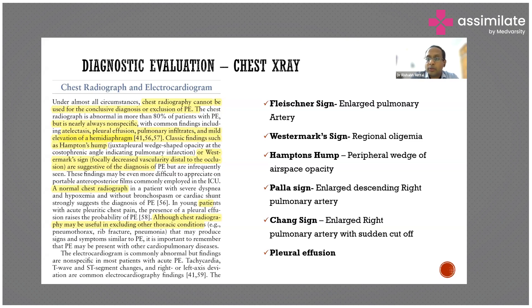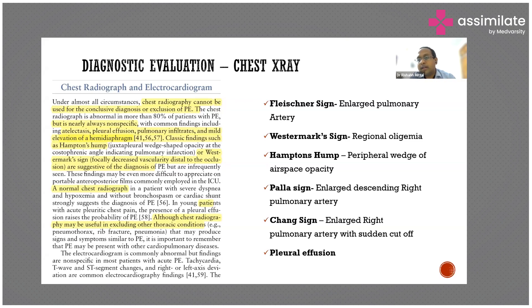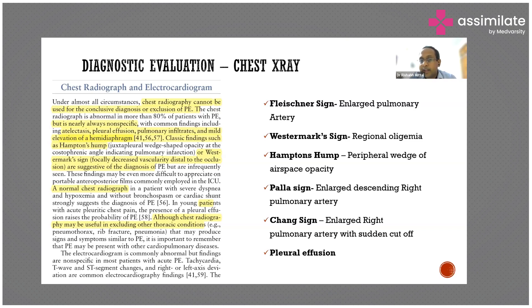Hampton's Hump is another frequently asked question. It represents a pulmonary infarct — the embolus goes to a distal pulmonary artery, blocks the blood supply to that part of the lung, and that part gets infarcted. This will appear on x-ray as a consolidation-like opacity in that area. The third common sign is Fleischner sign, which is an enlarged pulmonary artery, also called Palla sign or Chang sign.